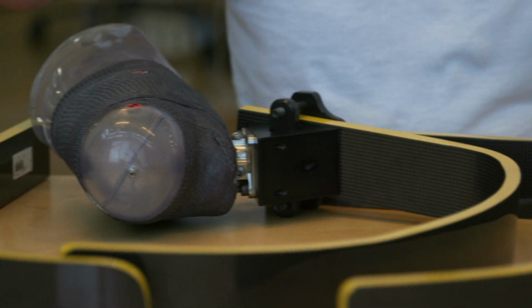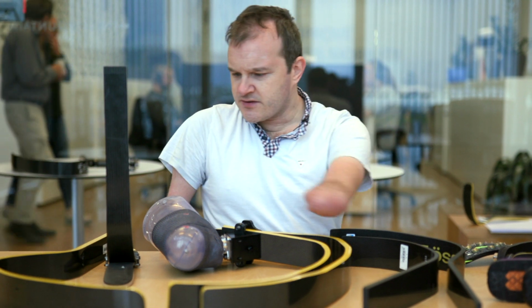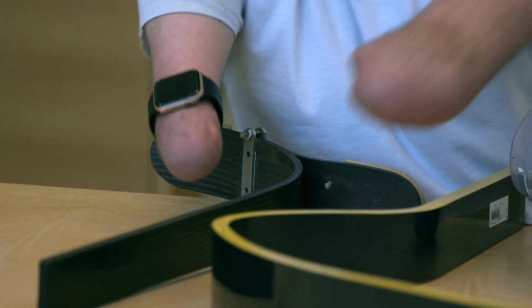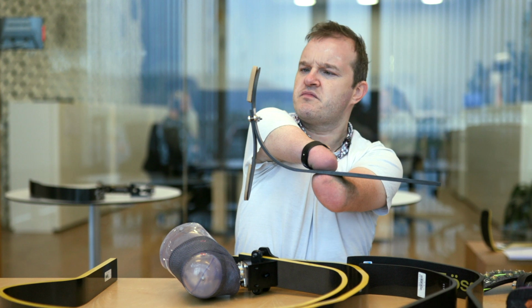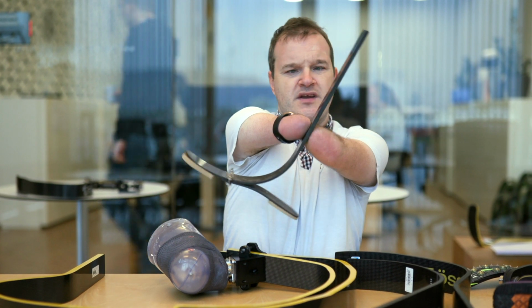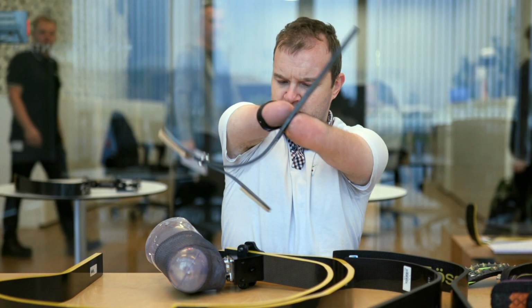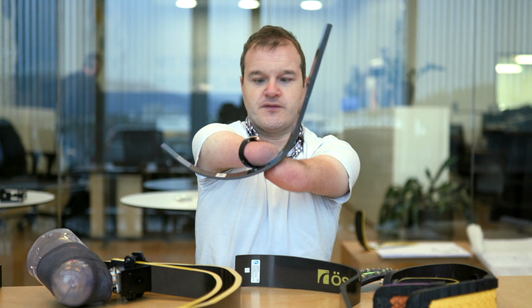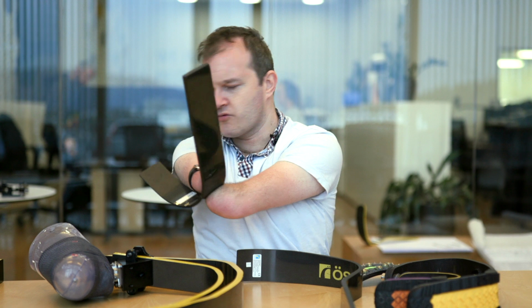So I've got a selection of running blades here on the table in front of me, and different iterations through the years. And the one thing that really strikes me is it's kind of been evolution more than revolution. This was the original design, which is now about 20 or 30 years old, and it's got that classic sort of C shape that you can recognise. These are the blades that I personally have at home. I need to wear them more than I do, and this is the flex foot, which again was a slight moderation on the original design.